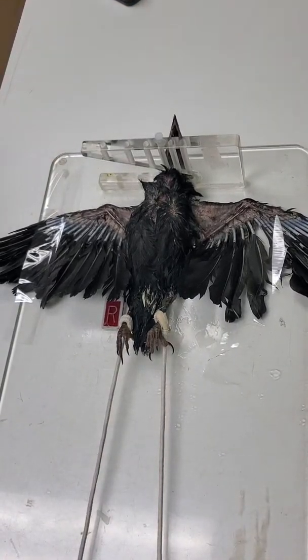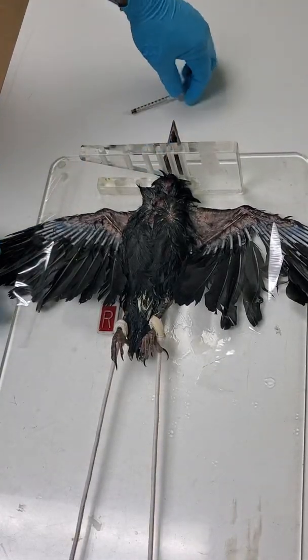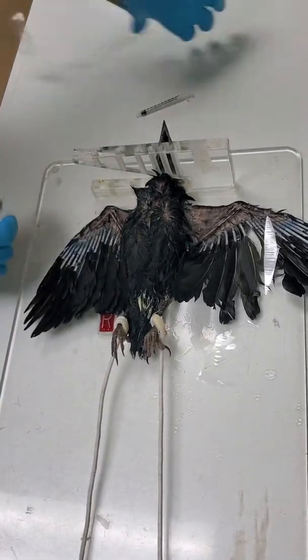I would adjust the KVP and MAS accordingly. And if I was going to do a lateral view, I would have to position the bird a little differently — obviously removing the wings from their current position.